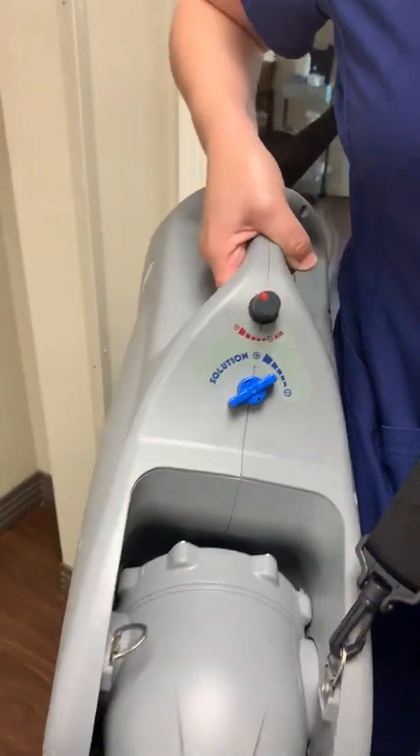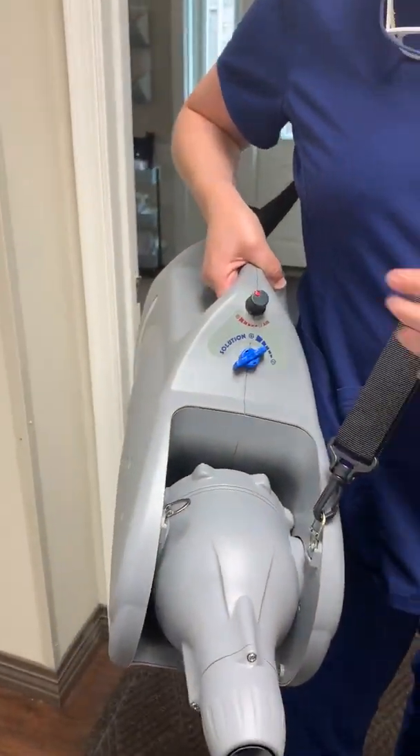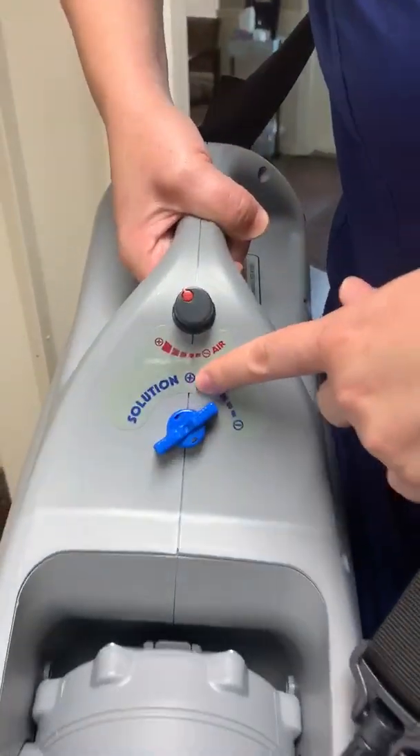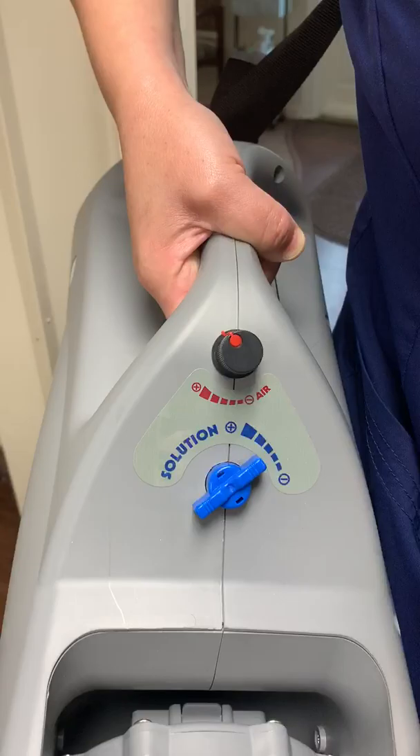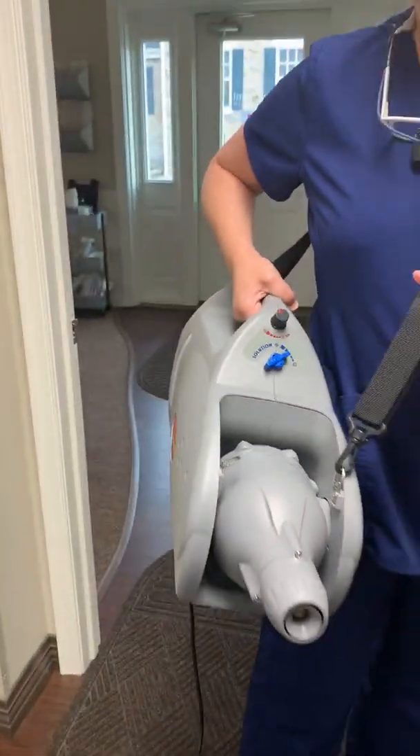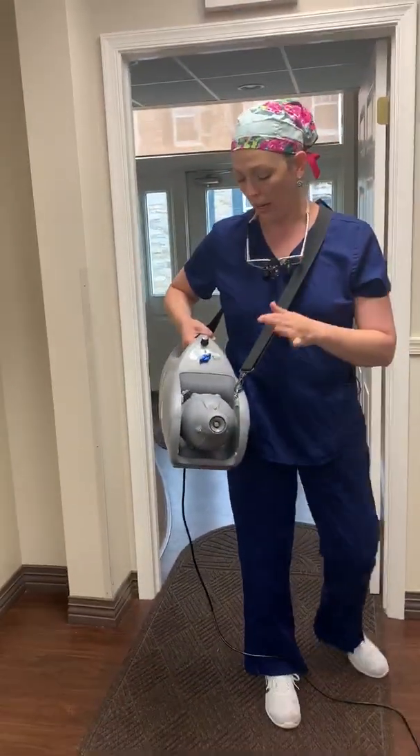It should fog and mist but nothing should be wet. When we turn it on, the power lining up right with the line on the machine seems to be a good setting. I'm going to show you in two of the hygiene operatories and then walk it out to the waiting area to show you what that looks like.